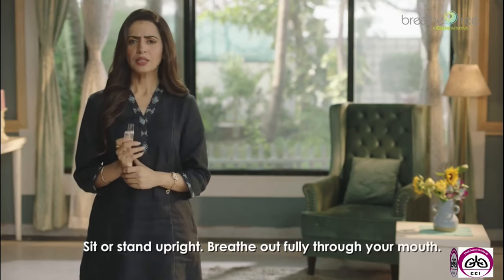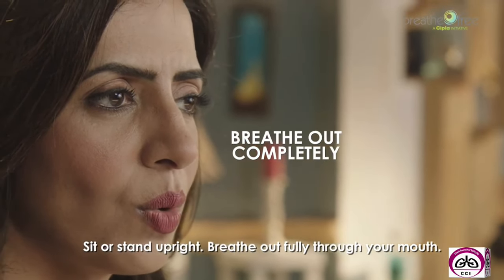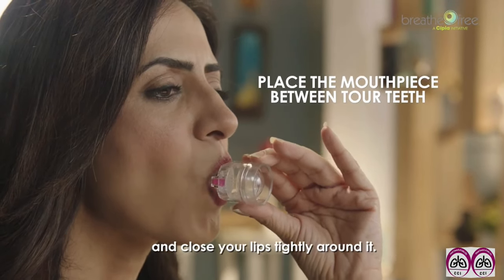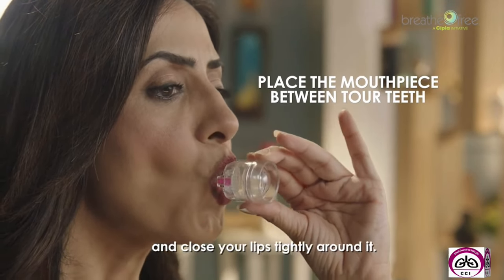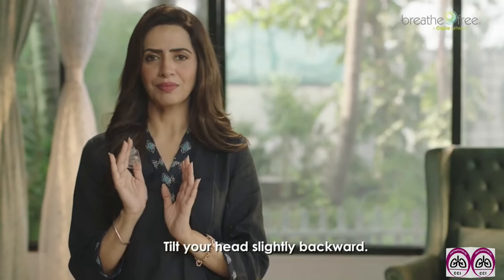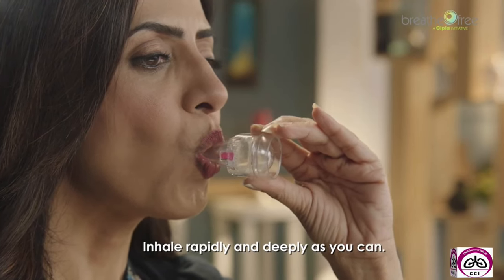Sit straight or stand upright. Breathe out fully through your mouth. Place the mouthpiece of the Rotahaler between your teeth and close your lips tightly around it. Tilt your head slightly backward. Inhale as rapidly and deeply as you can.